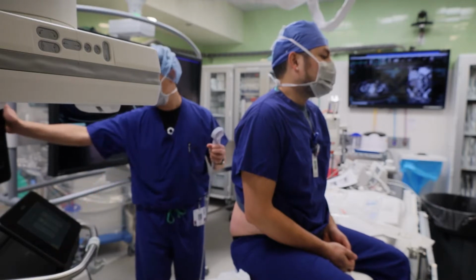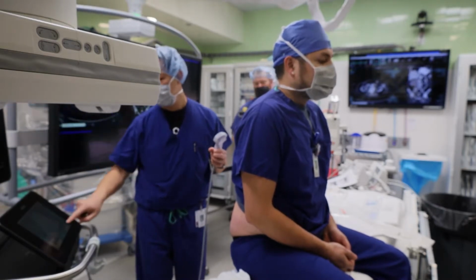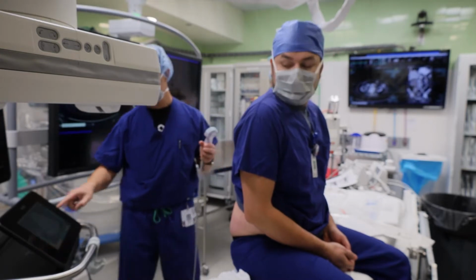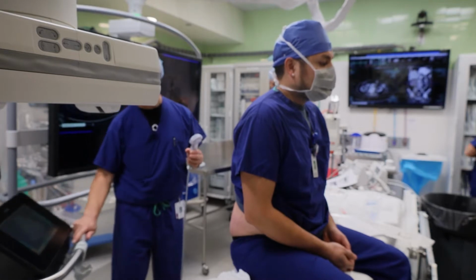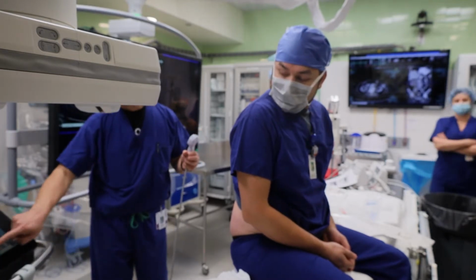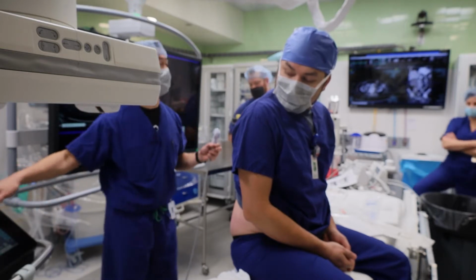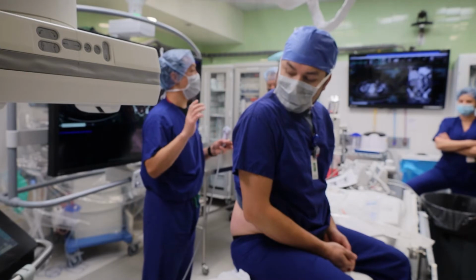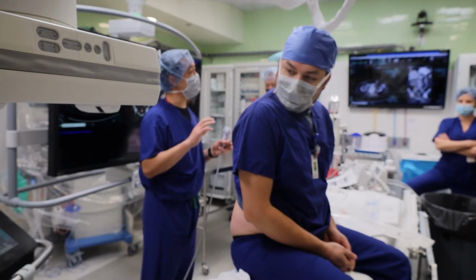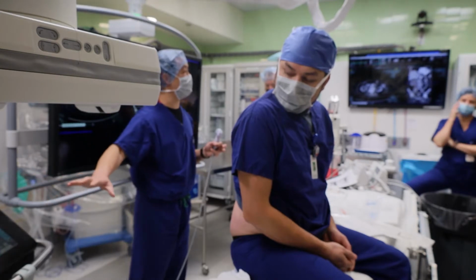All right, so we obviously put this on curvilinear mode. You sometimes see me messing with this panel here. This is kind of like the automatic point and shoot camera. If you have the SLR version of an ultrasound machine, there are way more knobs that this one is not allowing you to move.